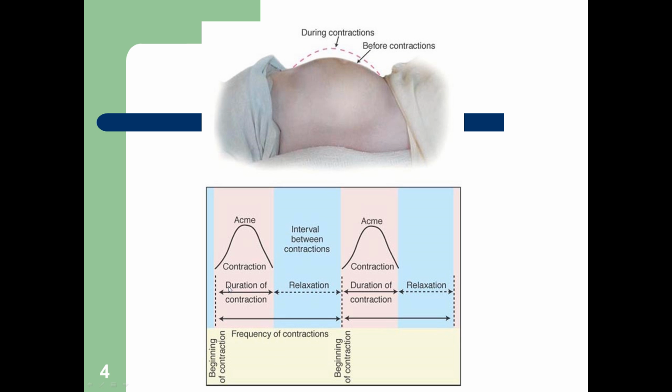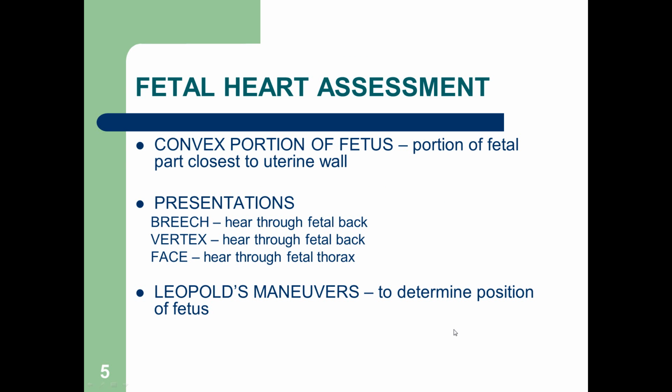So we've got duration, that's how long, okay? From the beginning to the end of the same contraction, that's how long it's lasted. Frequency is in between, from the start of one contraction to the start of the next, okay? Alrighty.